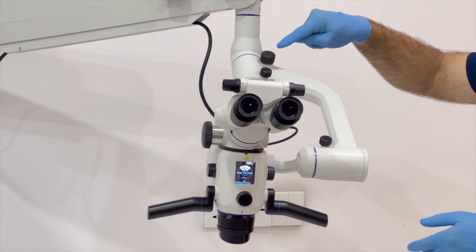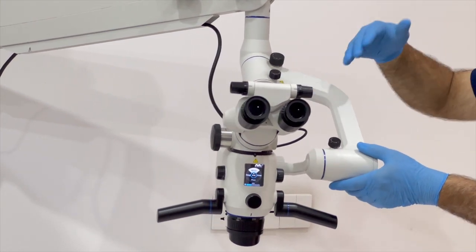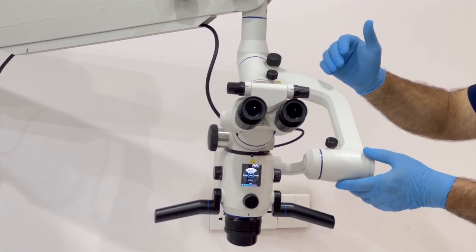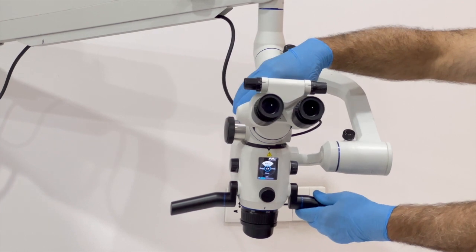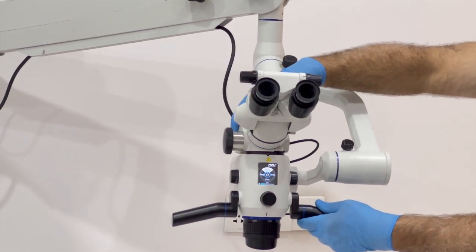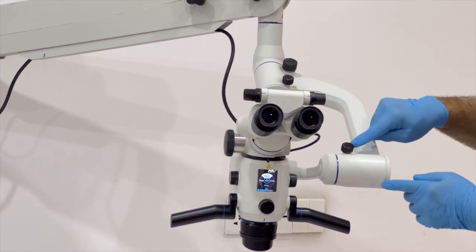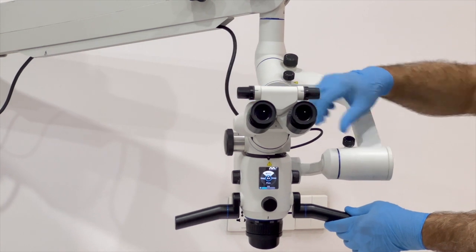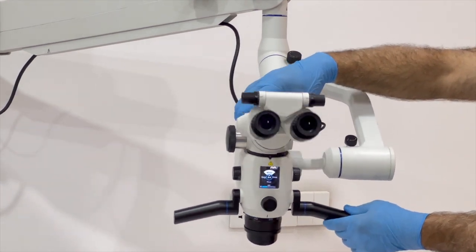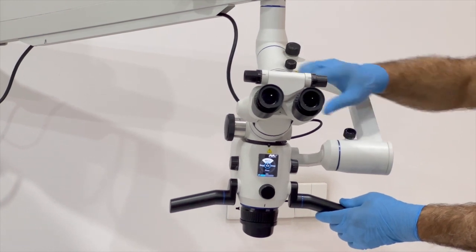Then this screw is responsible for the balancing of the rotation. I will talk about that later. Also we have the movement of the head. So we have anterior posterior rotation of the head. This screw is responsible for the rotation of the head anteriorly and posteriorly. So if you loosen it, it becomes loose. If you tighten it, it becomes tight.